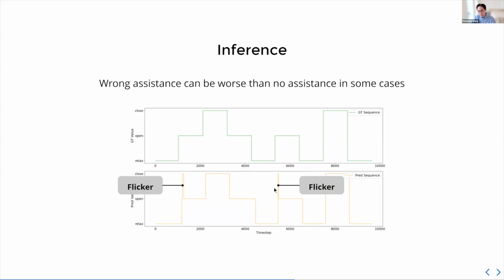This might not seem like a big problem at first, but if you think about the use case of the orthosis, this is actually very catastrophic. Say a person is trying to hold a bottle with hot water inside, so the hand is closed. If your model makes, even for a split second, an open prediction that triggers the device to open, you might drop the mug, you might spill water on yourself, you might hurt yourself.